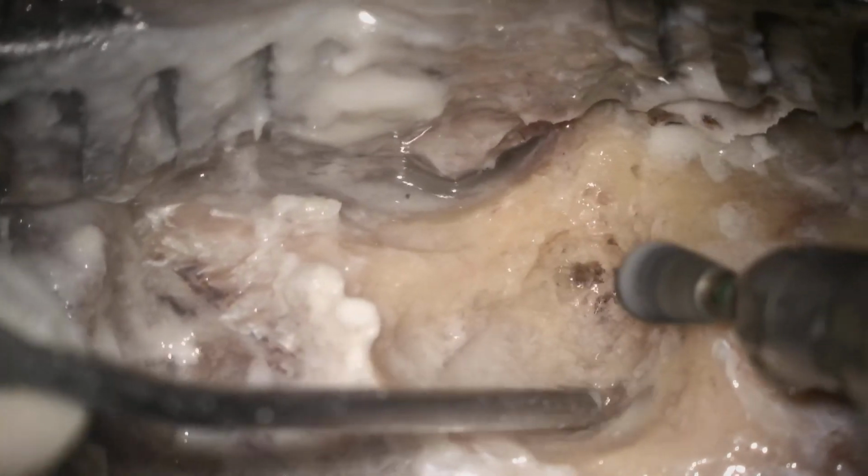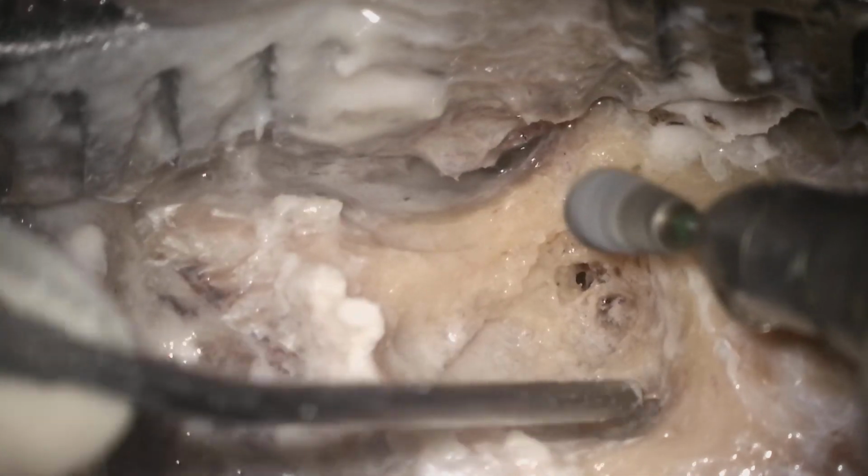Previously, X-ray was very helpful to identify the level of the tegmen and the sigmoid sinus. So if you know the actual position of the sigmoid and the actual position of the tegmen, then it will be very easy to dissect during the surgery. Okay. Okay, sir. Anything else? Yes, for now, boss.